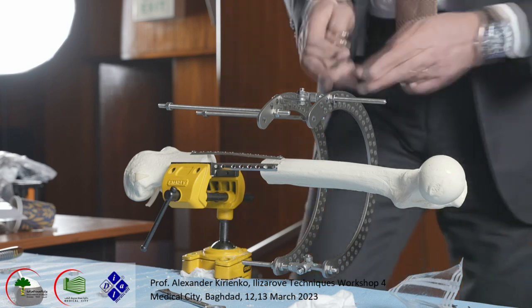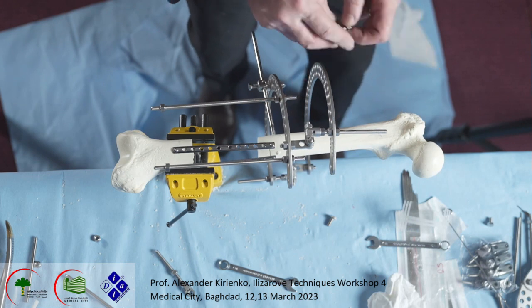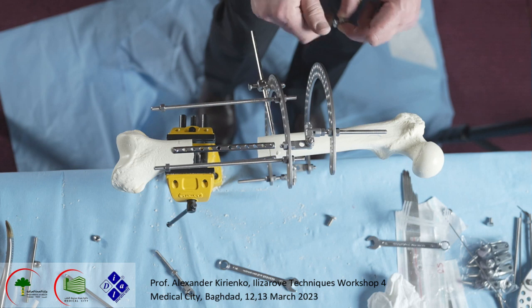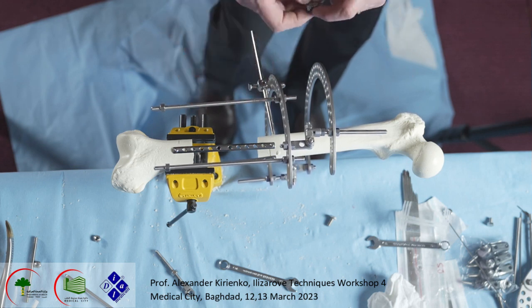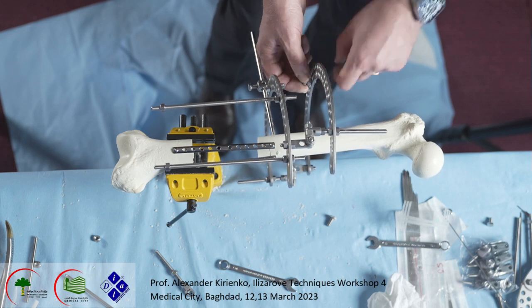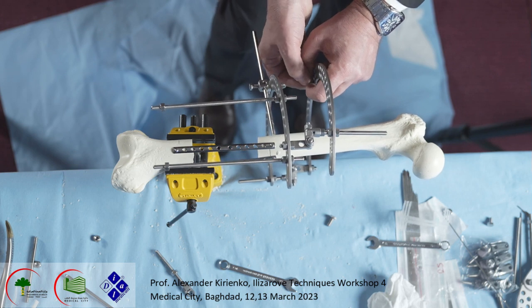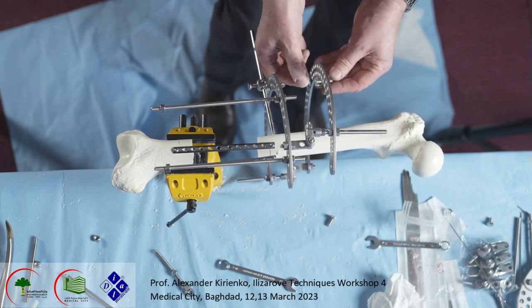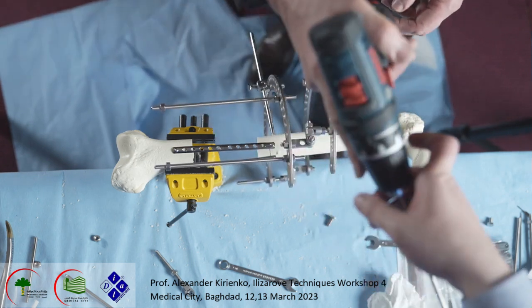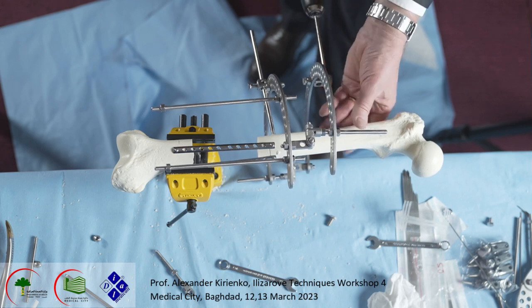We need to have a big space here between the osteotomy and the proximal half pin because the soft tissue is not so big for lengthening, because the defect is so big, 9 centimeters here. Okay. Do this.